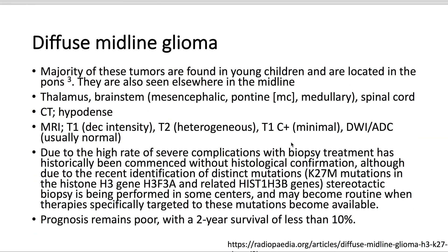Diffuse midline glioma is most common in young children and located in the pons. They are also seen elsewhere in the midline, including the thalamus, the medulla, and the spinal cord. On CT, they appear hypodense. On MRI, T1-weighted shows decreased intensity, heterogeneous on T2-weighted, and minimal post-contrast enhancement.